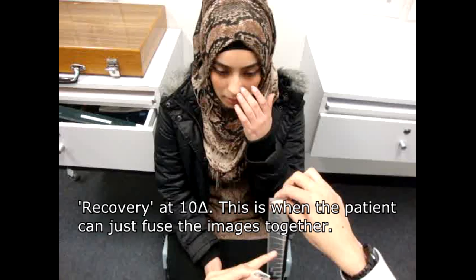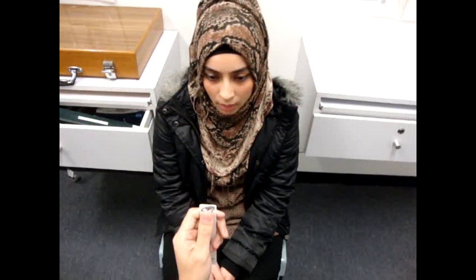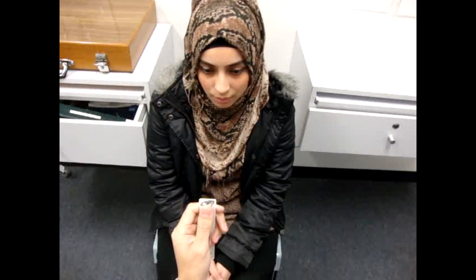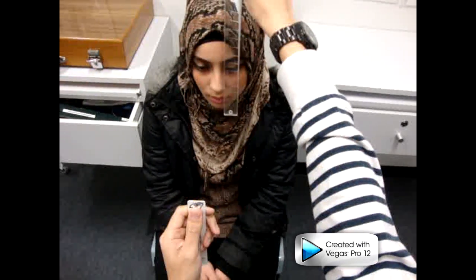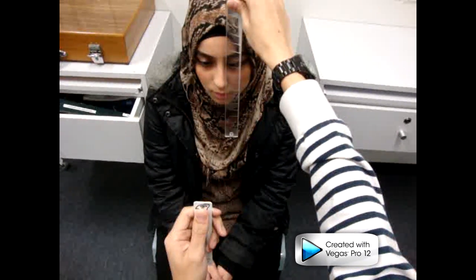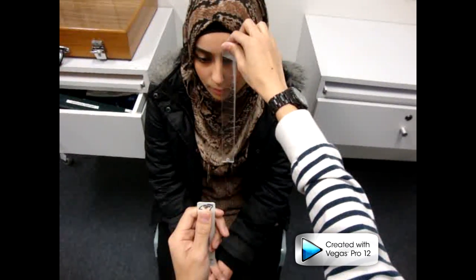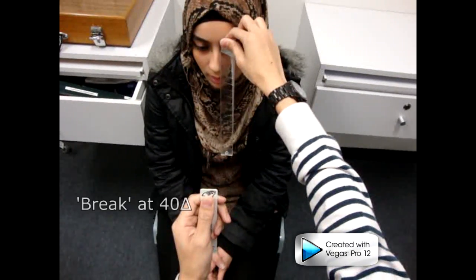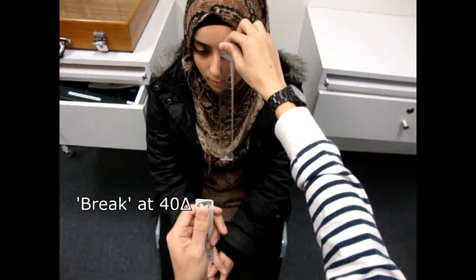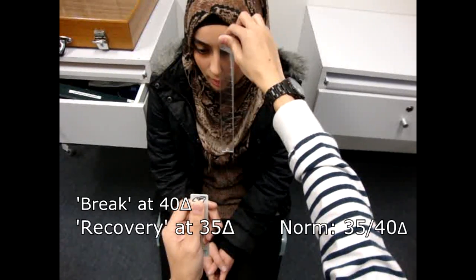We will now be testing the fusional convergence using base out. Yep, I'll get you to look at the O again for me. And once again, just tell me when it goes double. Yep, just about there. The patient has indicated a break at 40 diopters. And now just tell me when it becomes single again. Yep, there. The patient's recovery is at 35 diopters. Okay, thank you.